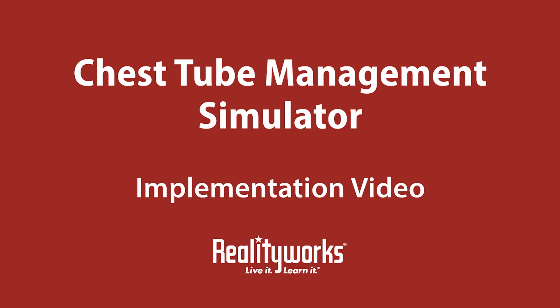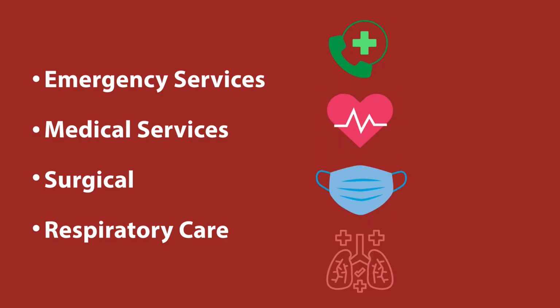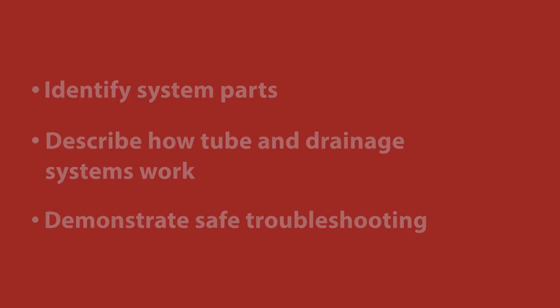This is the chest tube implementation support video. Welcome! Today we're focused on developing a foundation in chest tube management, a critical skill in emergency, medical surgical, and respiratory care careers. Some of our goals are that all participants will be able to explain the purpose of chest tubes, identify the parts of the system, describe how the tube and the drainage systems work, and demonstrate safe troubleshooting.